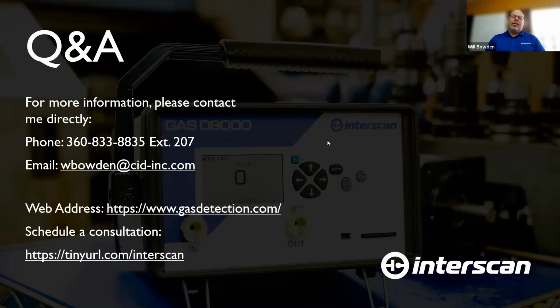Next item here is, what is the battery life of one of these instruments? Well, the Gas D8000, our portable instrument, has a rechargeable battery in there, and that's it. The standard time with that is roughly an 8-hour period. In terms of how long that battery is going to last with recharging over time, I don't have that right off the top of my head, but I can get the answer to that specific question, and we can provide it.